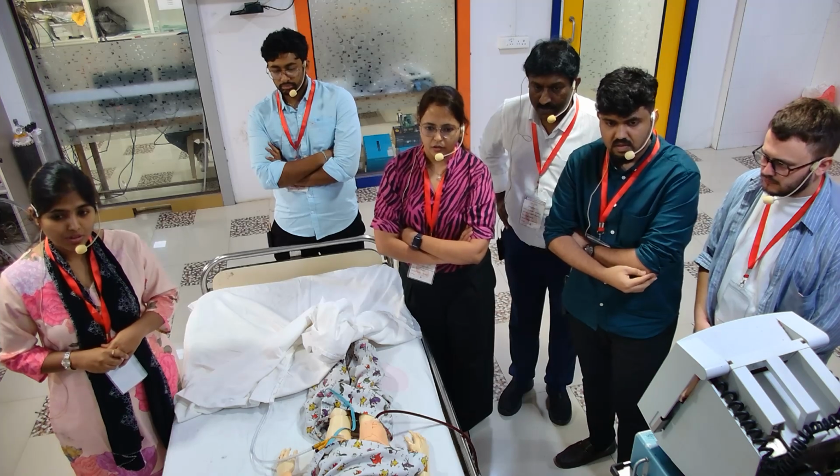I agree, we didn't. A bit before that, role allocation was not given. You have not divided yourself into a team. When you come here, you should have divided yourself into teams. These three persons are going to manage the patient, and these three persons are going to manage the circuit and everything.